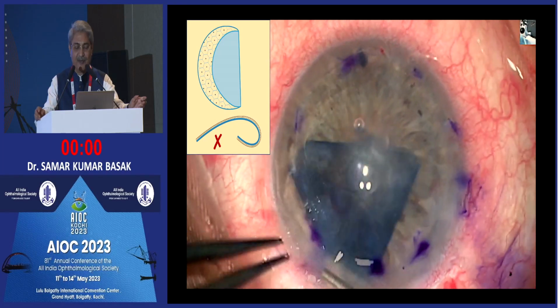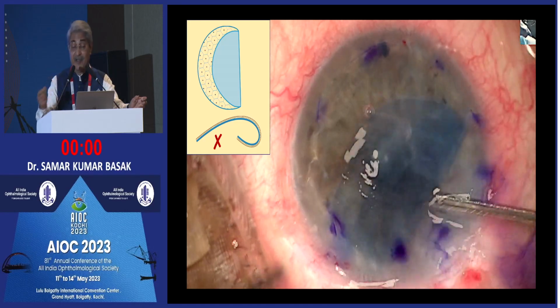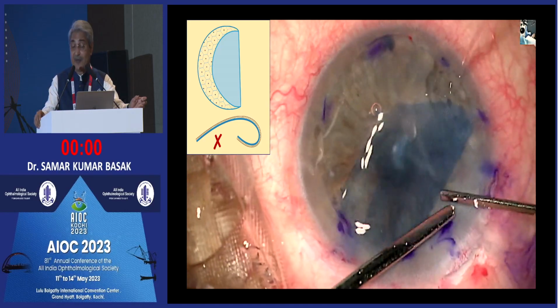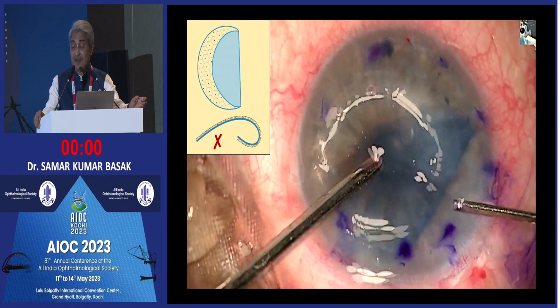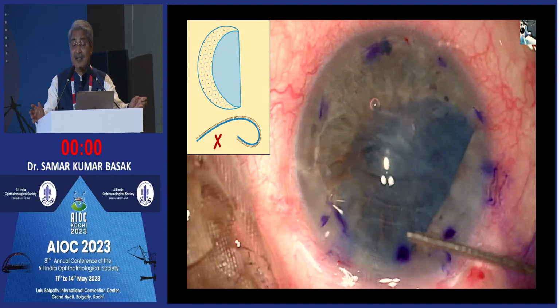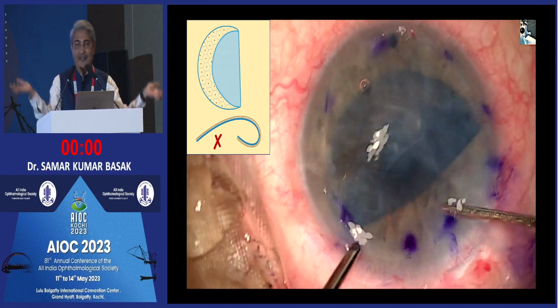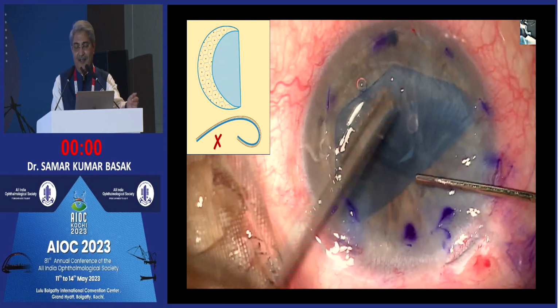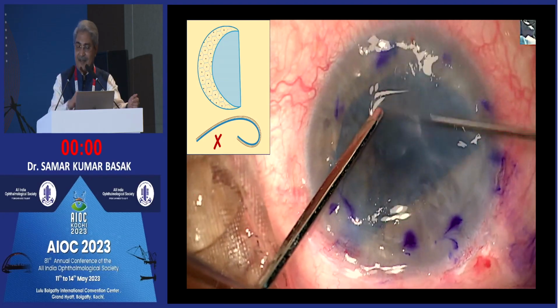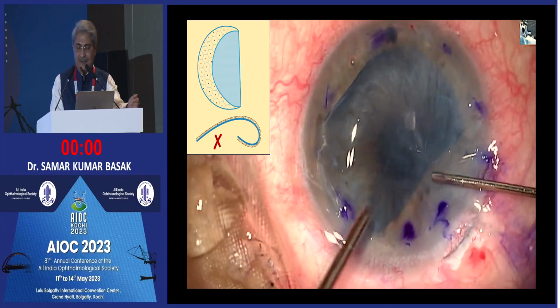Then we were stuck with a fibrin clot in one side port. Then ultimately I could open it, and it takes a little more time. But all this happens, it is not that easy a game. Always you will get it like this and open like this. So when you get a right taco, then again you can open it.